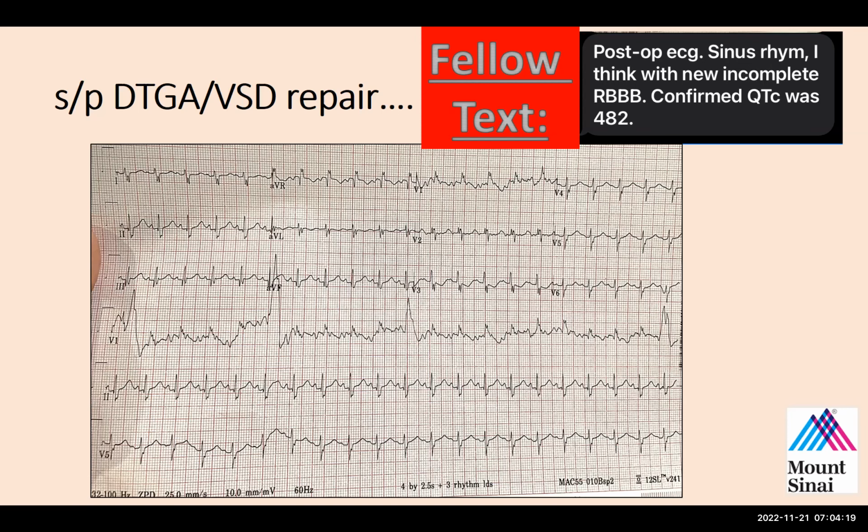I think yes. If it was longer than that, let's say they calculated it and it was in the 500s, and this person needed antiarrhythmic treatment, it could sway your decision making. This is, I would say, mildly prolonged, so I don't know that it would be as heavily weighing. Do you have any theories on why the QTC is a little longer than average in this patient? It can also be with your prolonged conduction, the incomplete bundle branch as well.